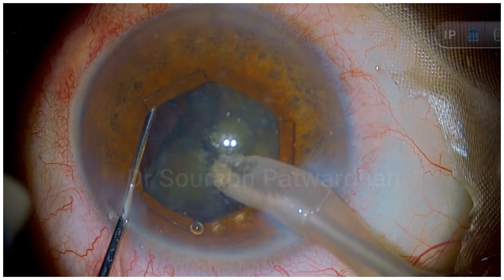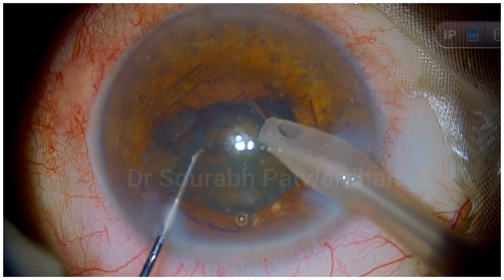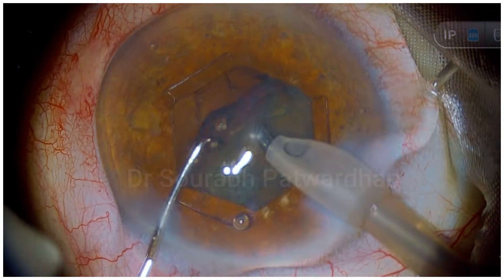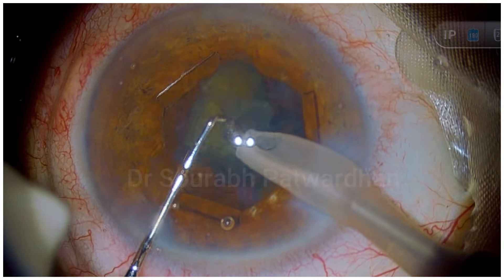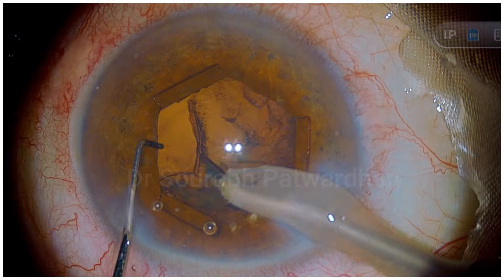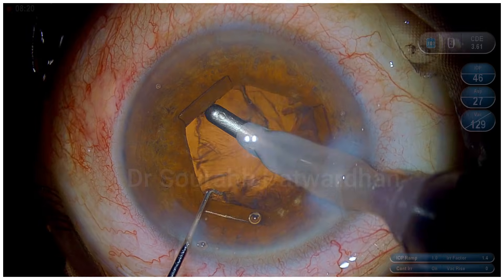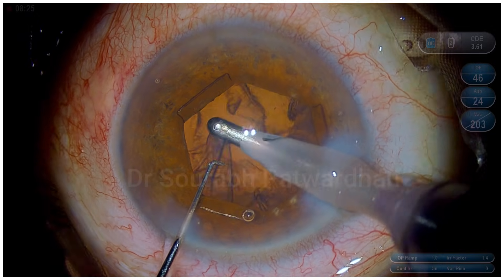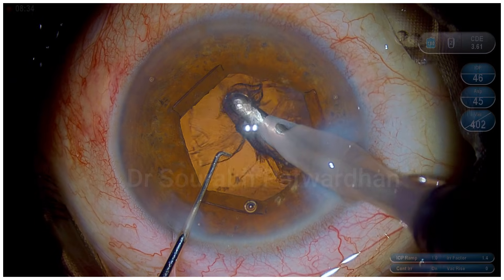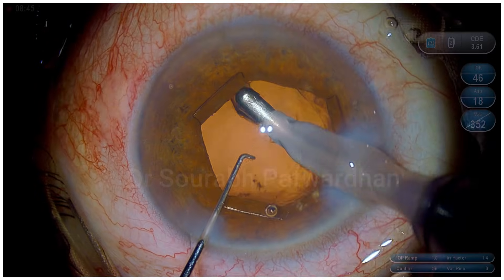You can see my bevel is sideways — I am attacking the anterior part of the nucleus so it tumbles and comes to center. Once one piece comes out, in soft cataracts the other pieces will follow. I hardly require any phaco energy here; mostly it is phaco aspiration which partially emulsifies but aspirates out the soft nucleus. The anterior chamber is shallow, so in these small pupil cases I make sure my phaco handpiece doesn't move a lot, as excessive movement increases anterior chamber fluctuations. For cortex aspiration, remove cortex from all areas; you can also push or pull the pupil around using the Bhex ring to check peripheral corners.